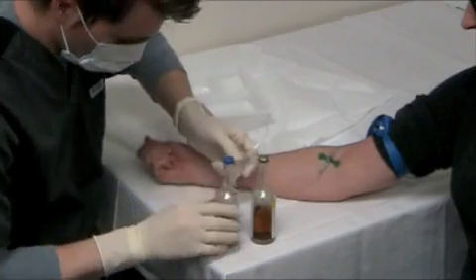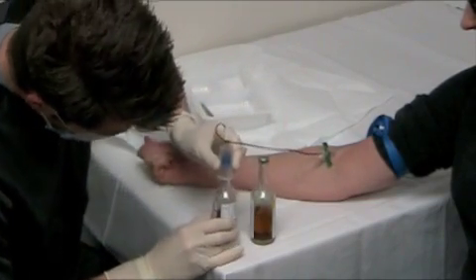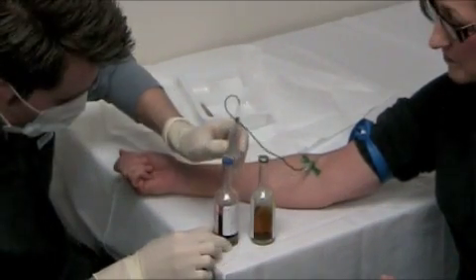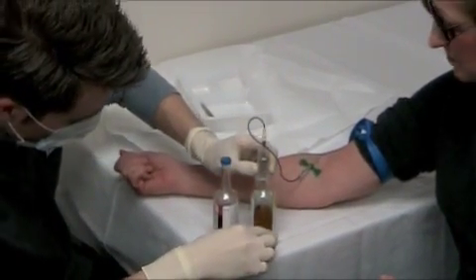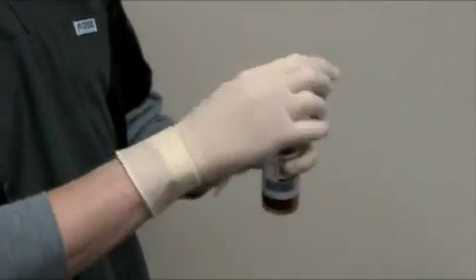Don sterile gloves immediately prior to venipuncture. Between 5 and 10 mls of blood should be collected per vial. Specimens for the aerobic vial should be drawn first, in order to prevent air from ruining the anaerobic environment. Do not cover the vial barcode or bottom while labelling.